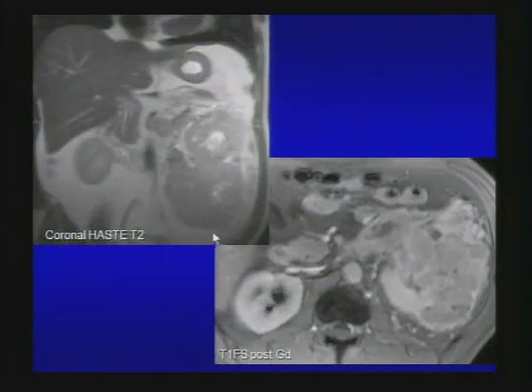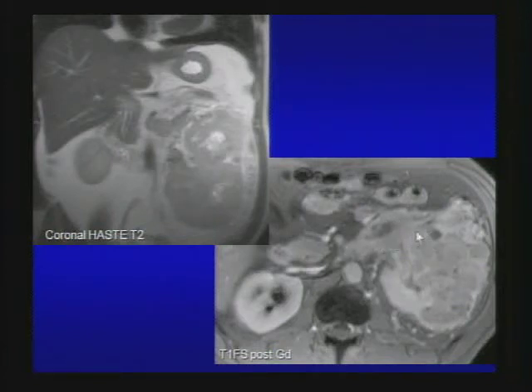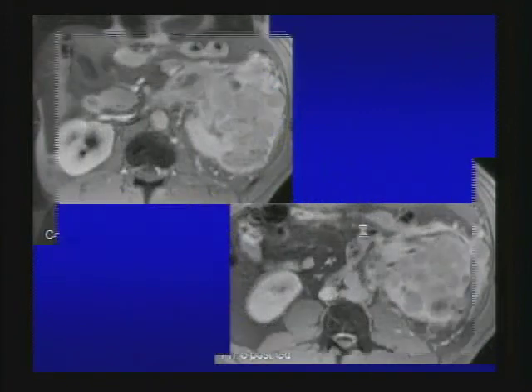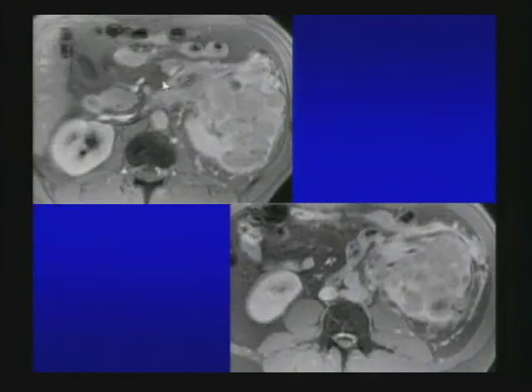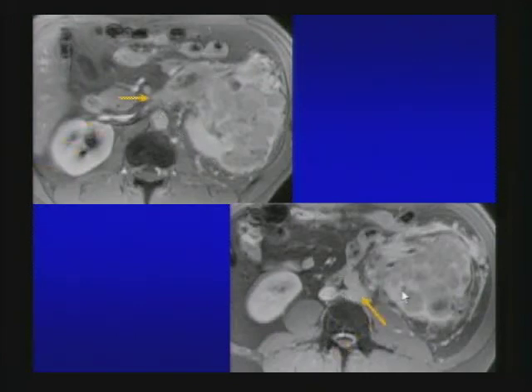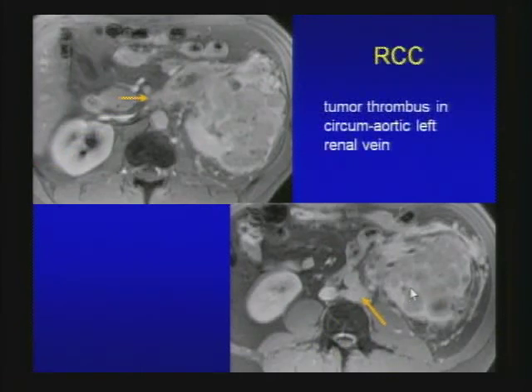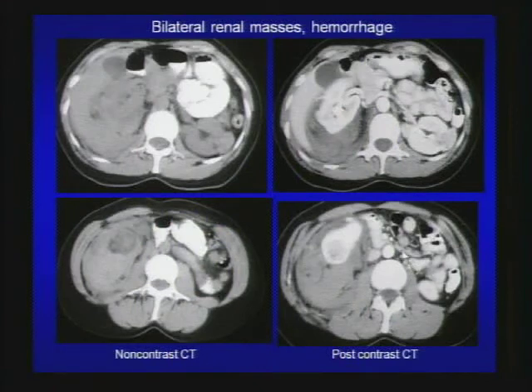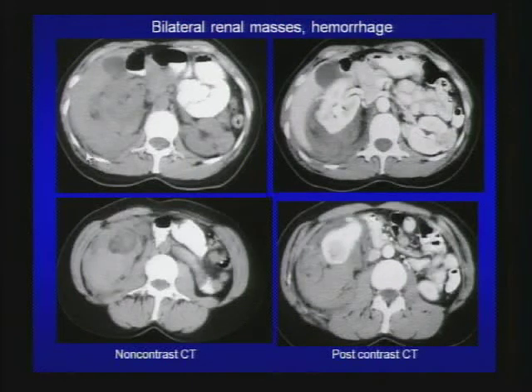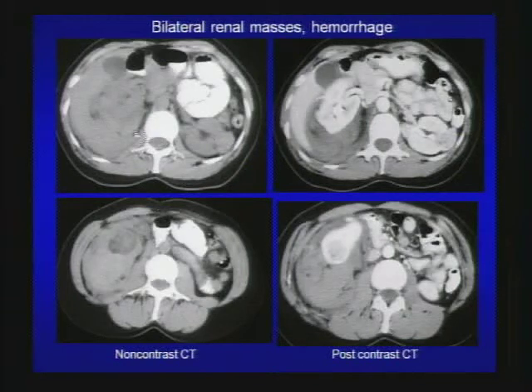Here's another case: coronal T2 HASTE showing a large heterogeneous mass from the left kidney. On post-gadolinium T1 images, the renal cell carcinoma with expansion of the left renal vein with tumor thrombus. On lower cuts you see the tumor thrombus in the left renal vein anterior and posterior to the aorta. This is a renal cell carcinoma with tumor thrombus in a circumaortic left renal vein.